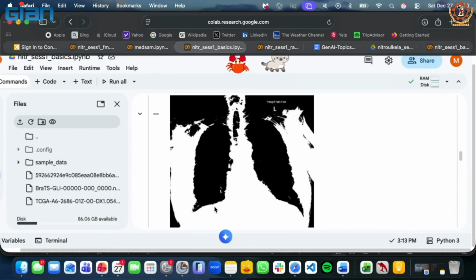But in order to detect the edges, you'll have to use a filter. So what's the basic difference here? Here, above the pixel value is 1, and below that pixel value is 0. But what an edge detection algorithm does is it takes another matrix, multiplies it in a convolution manner, and then detects the edges. And those thresholds are basically the thresholds of those filters.